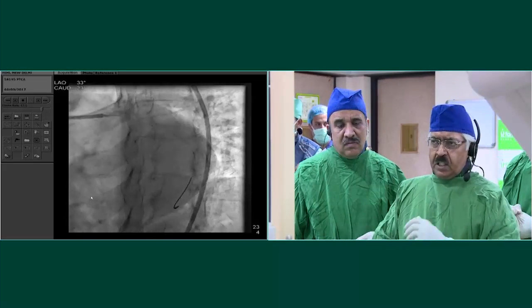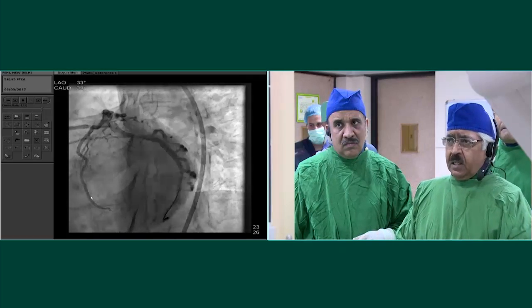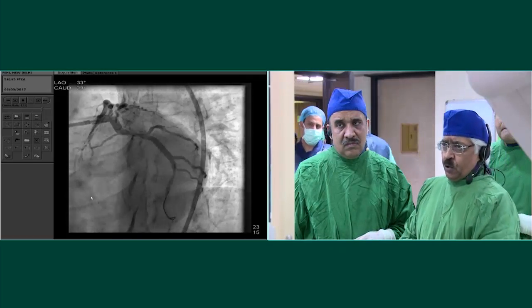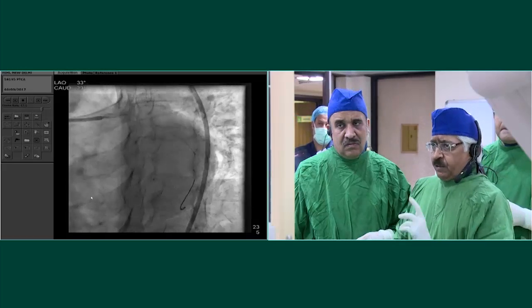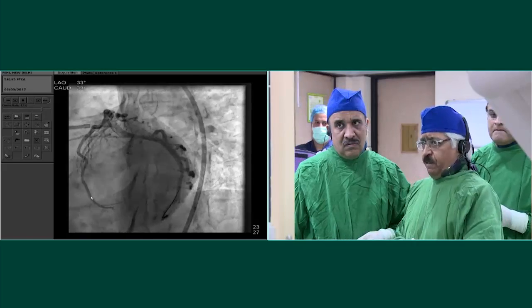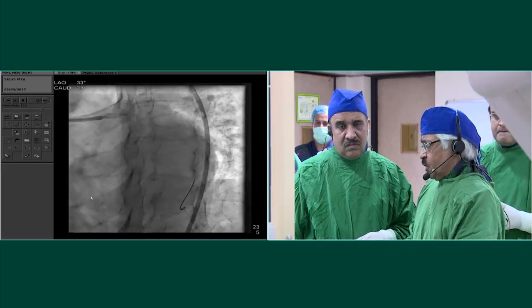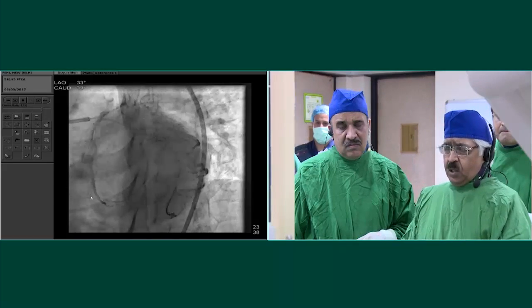We'll have to do a cutting balloon to the LAD, start from the ostia, and then implant it very carefully not to protrude into the ostia. But if I've got to do the LAD, I'd rather stent the circumflex first, because even if it was protruding, I don't want it catching onto my stent in the circumflex.